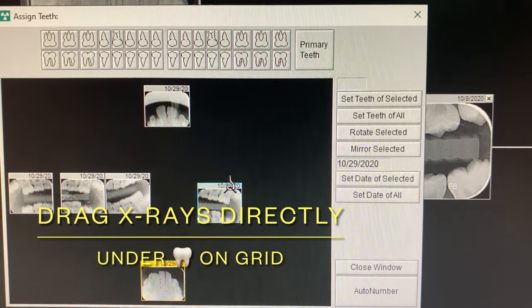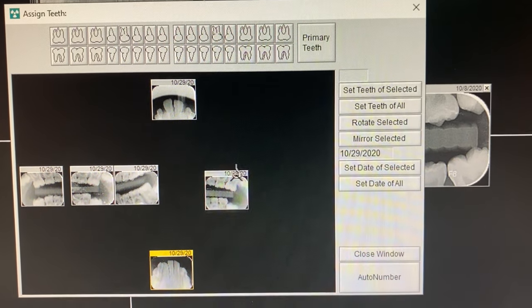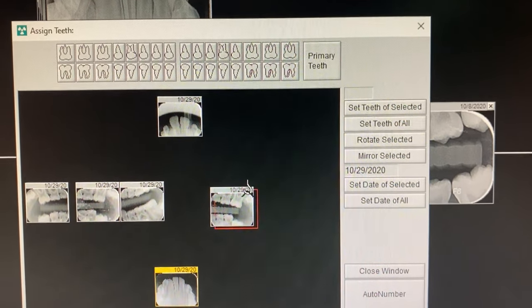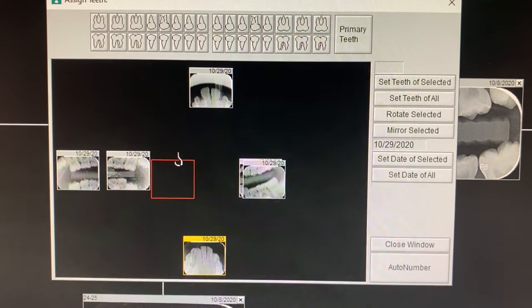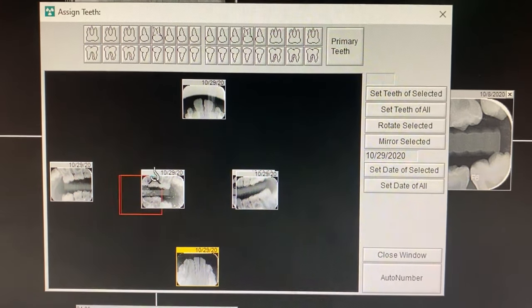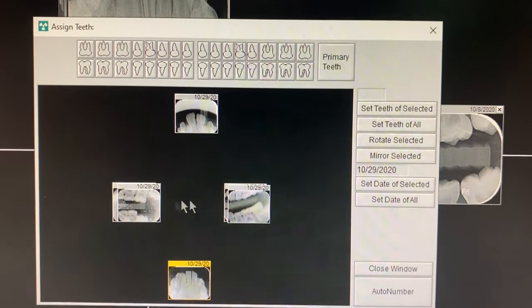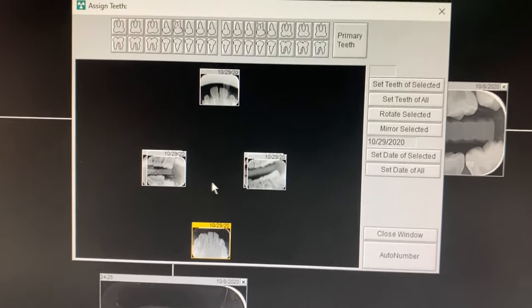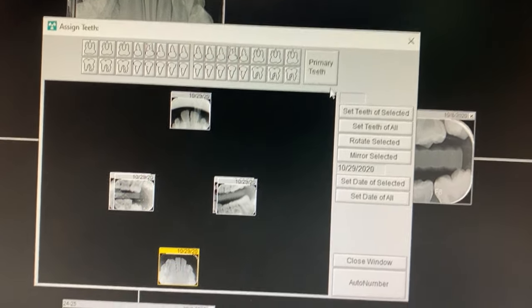If this was just primary dentition, I would line it up directly underneath just the primary teeth. This is probably the number one reason I see errors in mounting — putting this exactly on the grid, exactly underneath the teeth. Notice they're a little narrower than you'd expect, but that's correct.